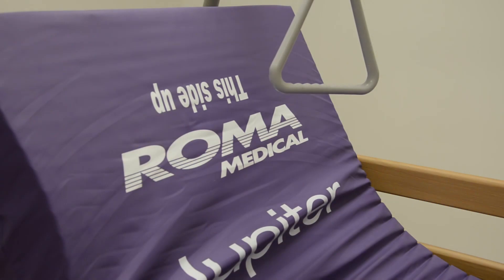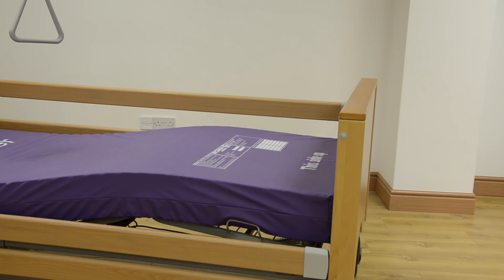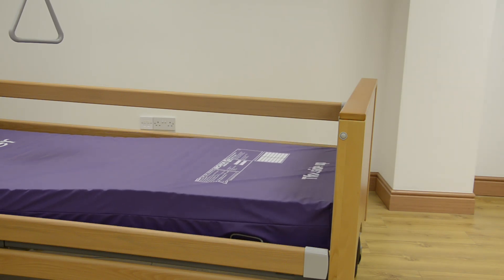We can also provide a pressure relieving mattress from Roma which fits perfectly with the Siesta bed. It's made from soft foam and offers superb comfort and support.